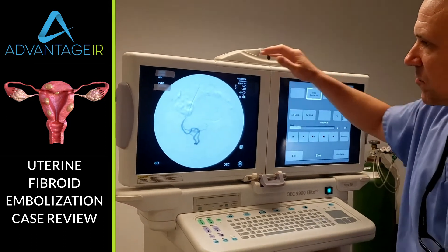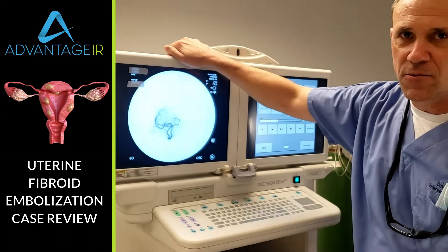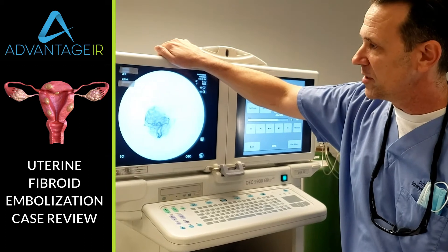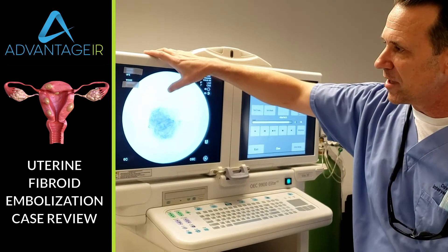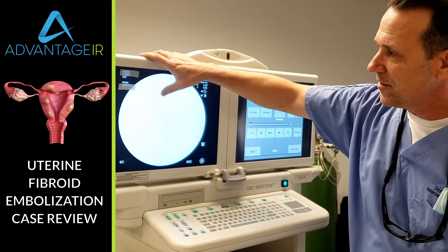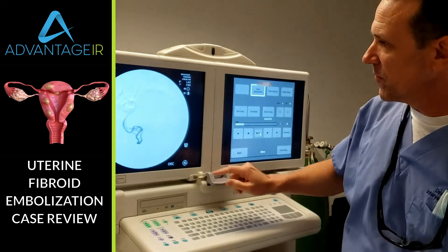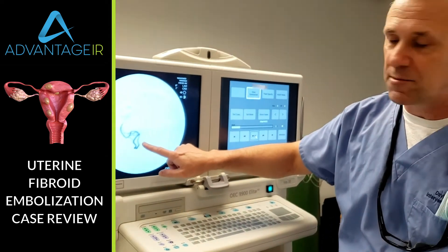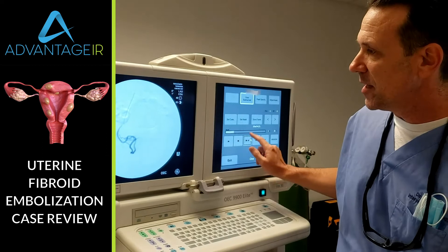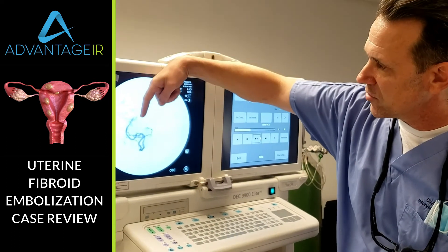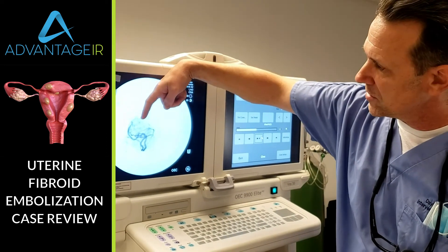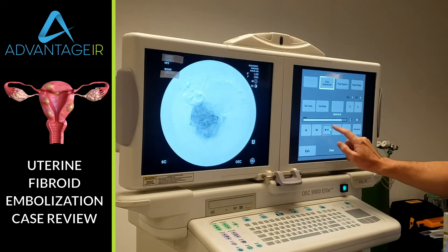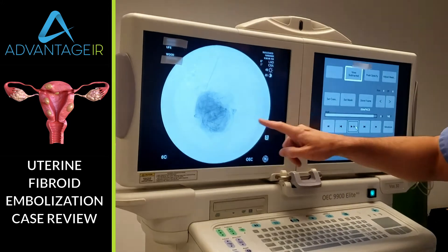Now this is the right side. We treated that left side with beads and finished, and now we're treating the right side. Here we're injecting contrast dye in the right uterine artery. We freeze that and see how big that uterine artery is — several times bigger than it should be. Now we let it play out and watch as that contrast dye perfuses into this fibroid tissue — a densely vascular fibroid, as fibroids always are.